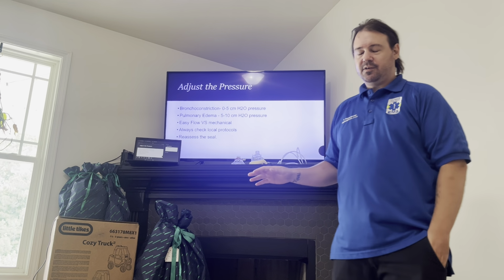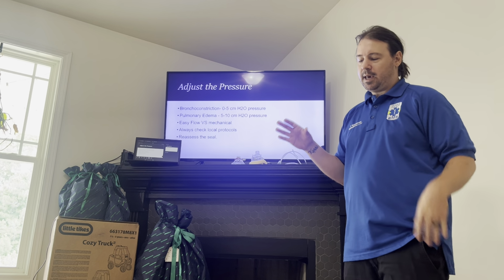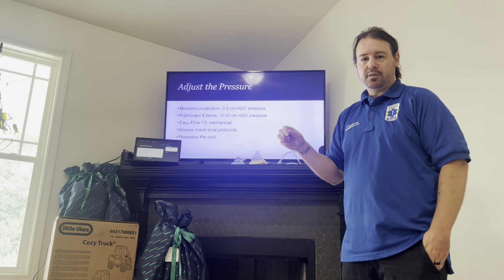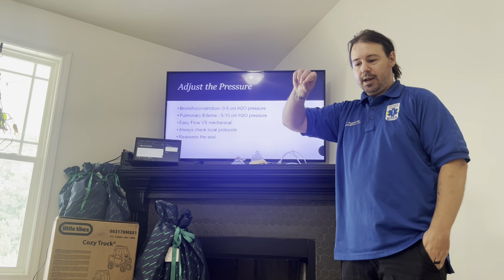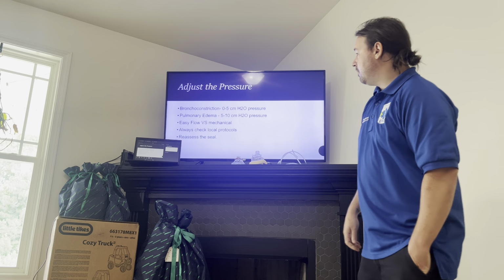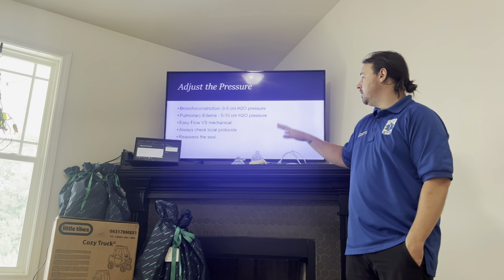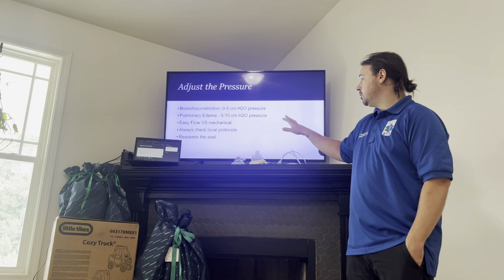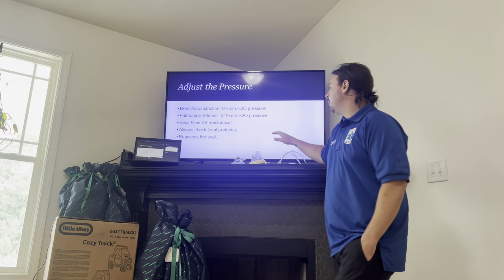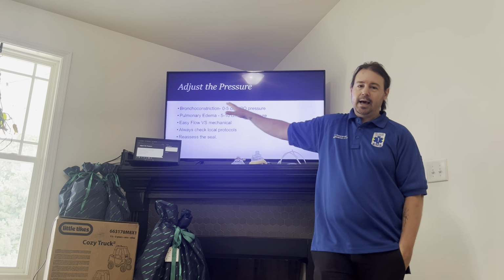In comparison to the mechanical CPAP, if you remember the box on the screen that we were looking at, the mechanical CPAP actually had a dial that you need to adjust the pressure with. You physically go in and move the pressure, and the box will set the pressure. Again, those are a little more outdated. We don't see those as much, but you do need to be prepared to adjust the pressure using both. So always check your local protocols. Do not run off these numbers. These are just a guideline.